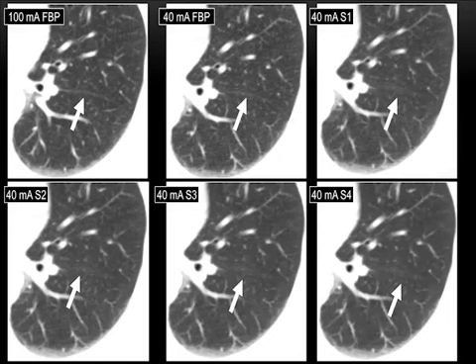So this is literally the disappearance of a major structure in the lungs, which is definitely not accepted by any of the thoracic radiologists. So it's very crucial to pick the right setting. Probably even I can kind of hallucinate that there's a fissure over here based on prior knowledge. But the key message here is you're lowering noise, but be careful about the visibility of smaller structures.